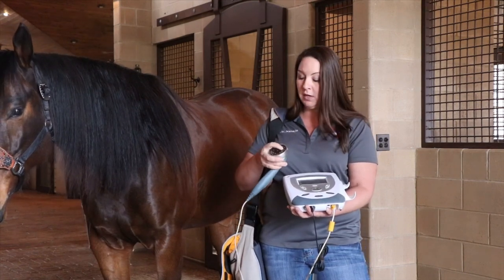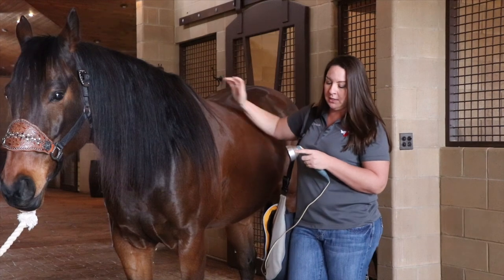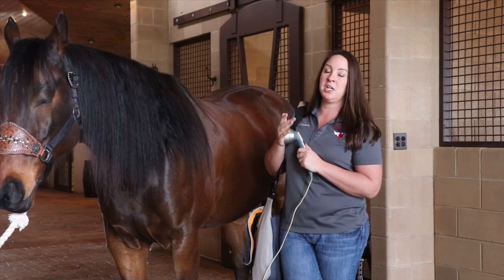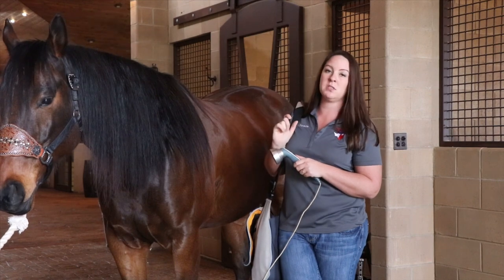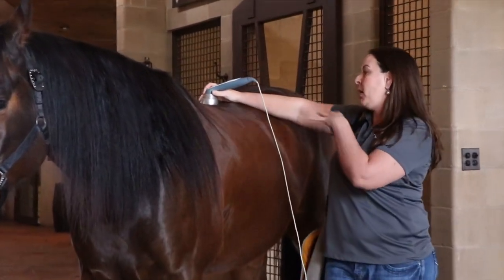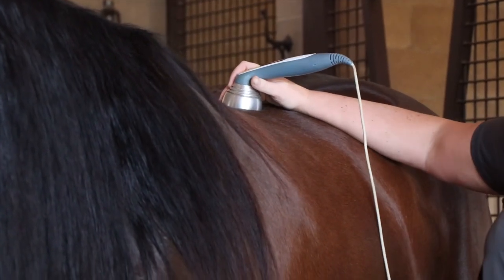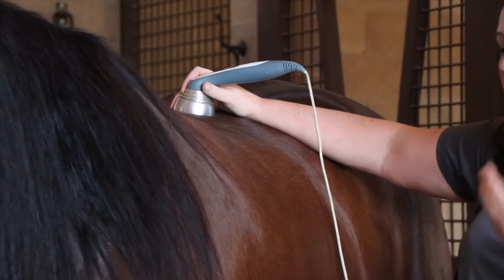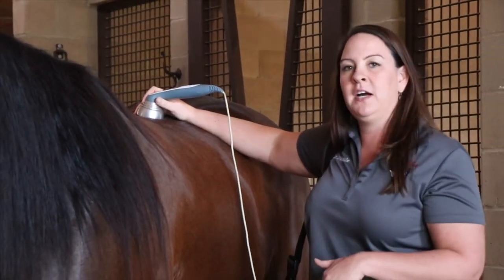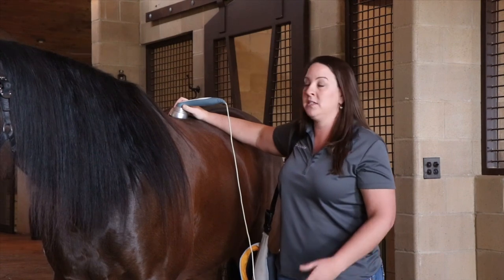Having 33 diodes is a huge selling point — it's all about the power behind the laser, so I get to treat a very large area with a lot of laser beams versus a smaller laser with less power and fewer beams. For safety, every class 3B laser is going to have some type of cutoff switch, because even though it doesn't get hot and is safe to the touch, it can still be very dangerous to your eyes and your horse's eyes. I use my laser mostly on spinal injuries. When I adjust chiropractic-wise, I'm fixing misalignments and looking for back soreness, then I go back and treat the areas that were most sore. Chiropractic care aligns the spine and takes pressure off the nerve, but there's often residual soreness and muscle spasm — and I get better results when I use the combination of chiropractic and cold laser.